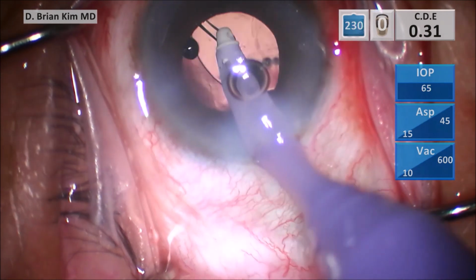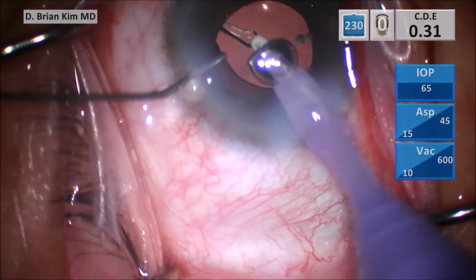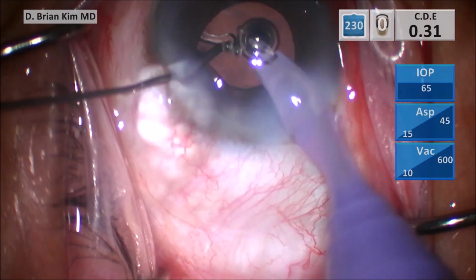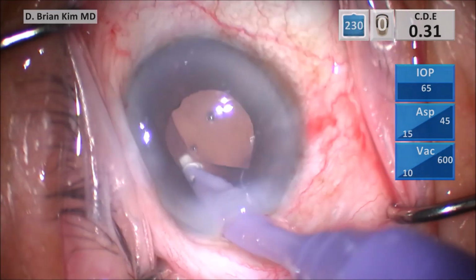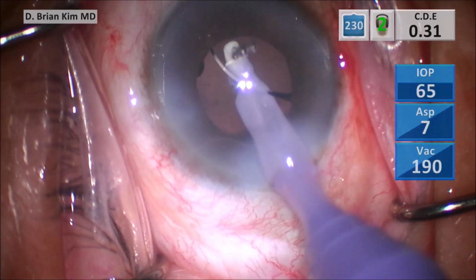I'm pushing and pushing. There's no reason to get frustrated. You don't want to cause any traction or stress on the zonules. So what you want to do is a two-handed technique, and I just use my BSS cannula. And as I stabilize the optic with the I/A handpiece, I use the cannula to tease off and push the haptic off, and you can see that released very nicely.